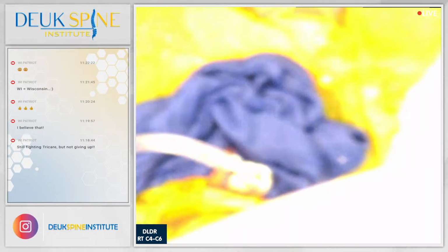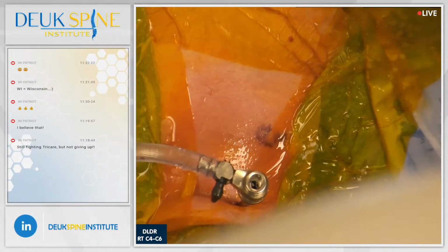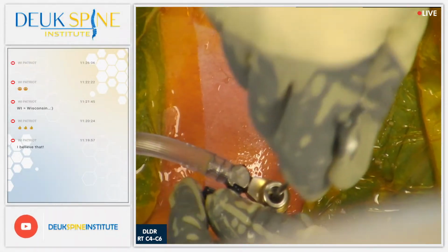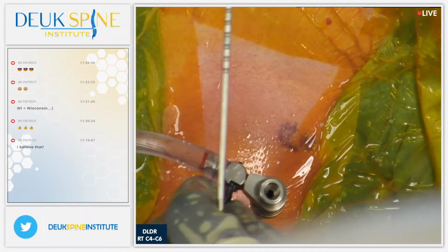That's another lesson for you all. No surgeon can get 100% of a herniation. I tell all my patients, 50% is what we shoot for. I mean, I shoot for 100, but you need about 50% to get rid of symptoms.